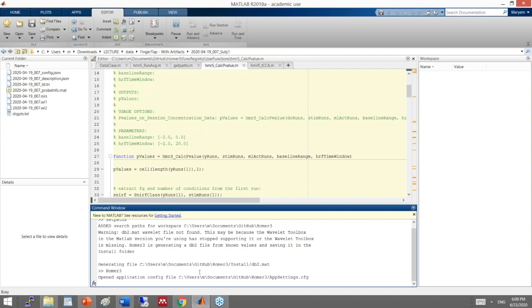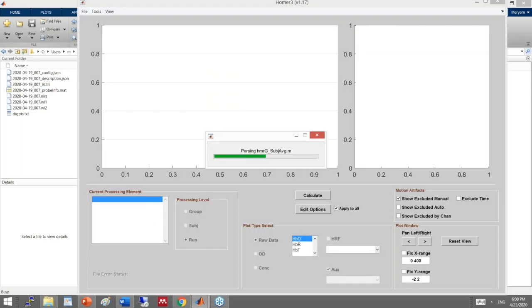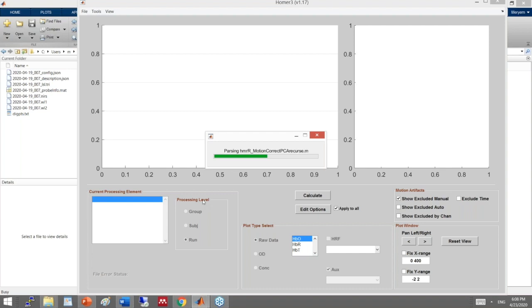On first launch, Homer3 goes through the function registry folder, checking and parsing each function's help section. You'll see it parsing functions like 'hmr_glm' because I deleted the registry file to demonstrate this. On subsequent launches, it will not repeat this parsing. The interface looks very similar to Homer2, so there should be no issue transitioning.